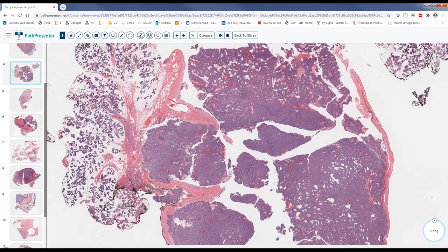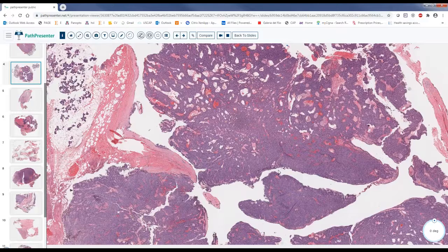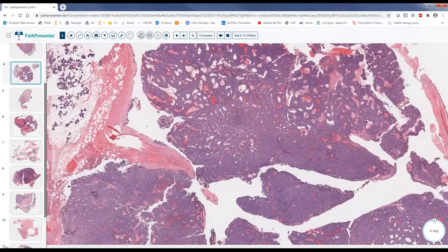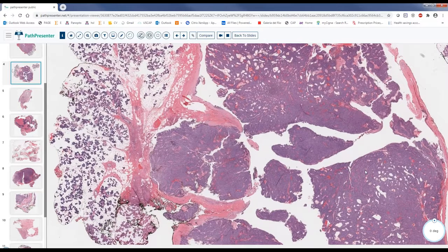Like the follicular lesion of the thyroid. Yes. You will be convinced when you see that. Again, nuclear atypia and all the features that usually differentiate between benign and malignant, here we don't have that. So we cannot say that it is adenoma versus carcinoma based on cytology.